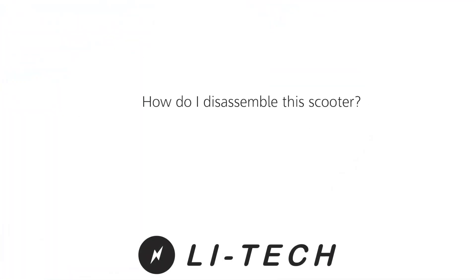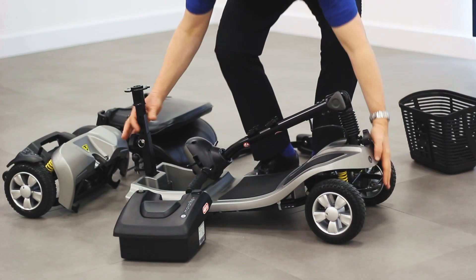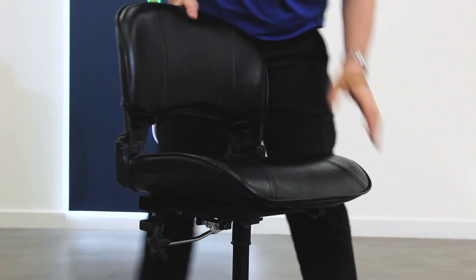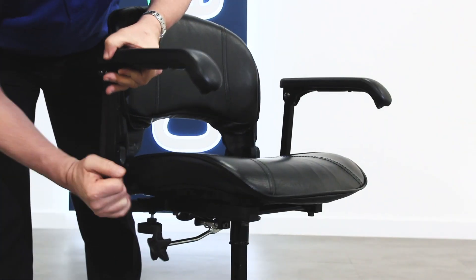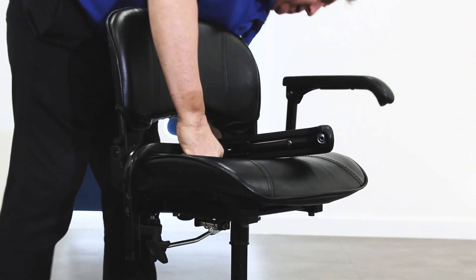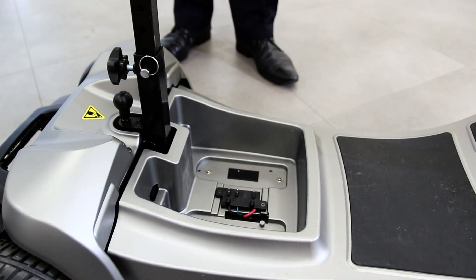How do I disassemble this scooter? To disassemble the LIHTEC Marathon, start by removing the seat. Fold down the backrest and lift the lever underneath to release the seat from the seat post. You can remove the armrests to reduce the size and weight of the seat. Lift the battery by the handle to remove it from the scooter body.